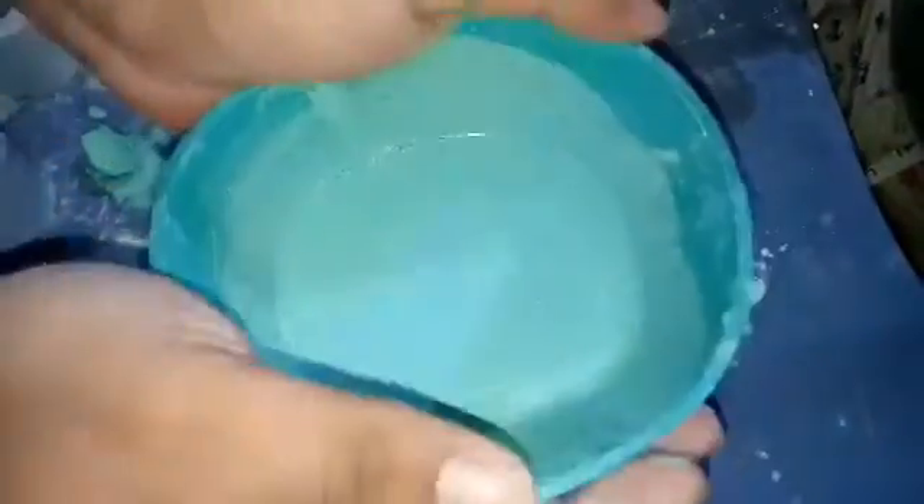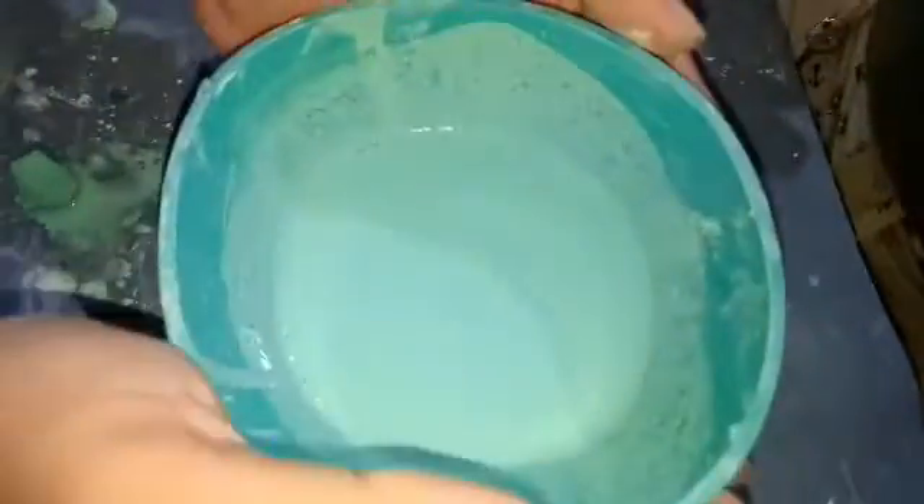Hit it at all angles so that the bubbles come out from each angle. Now you can see there are no bubbles in this bowl — it is ready to pour into the molds.